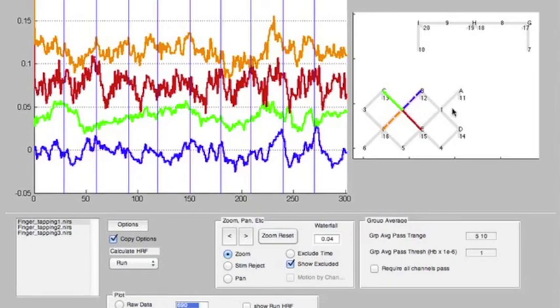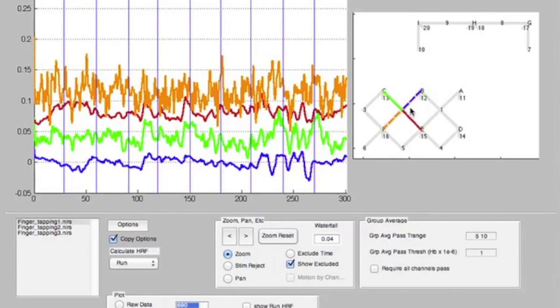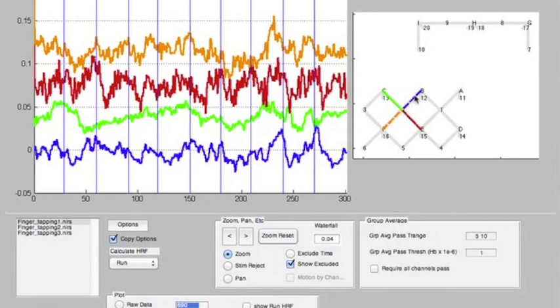If I move over here, you can see that those channels I selected have a pink background. That's to remind you that those channels have been marked to not be considered in the data analysis. When you come back over here, you see it's a dashed line. I can just click it again, and that marking has been removed.